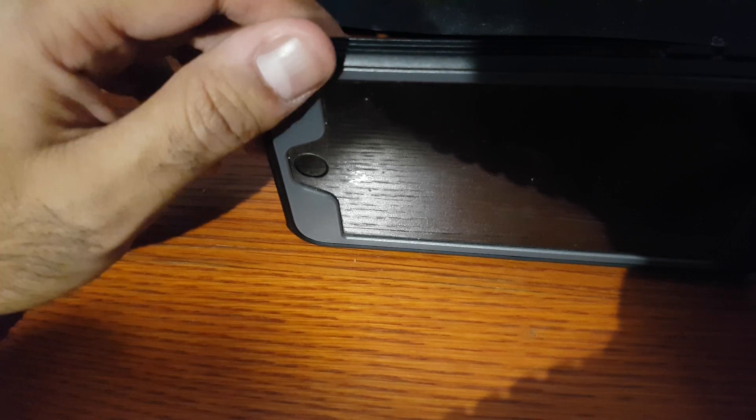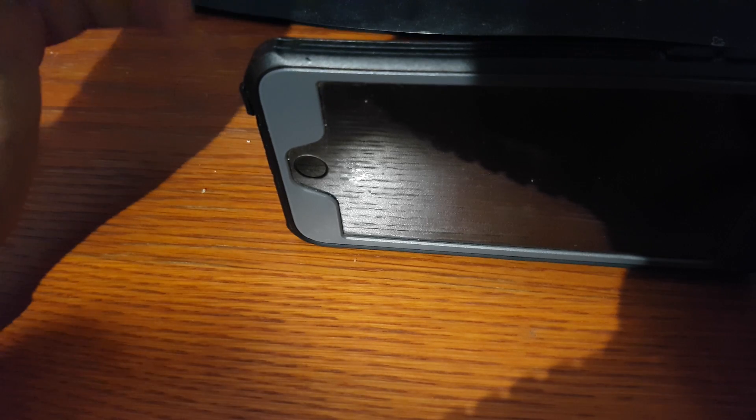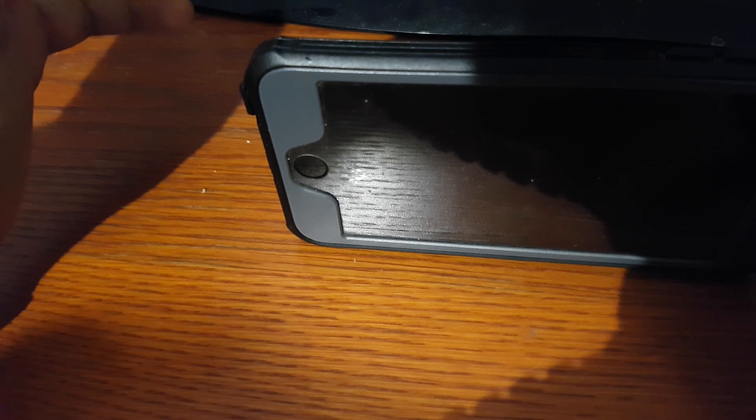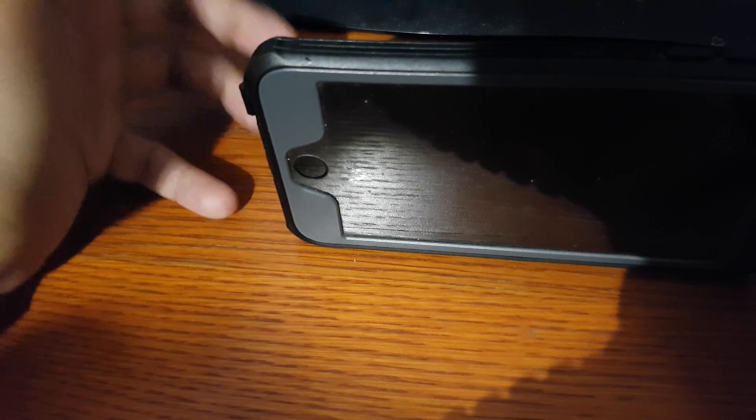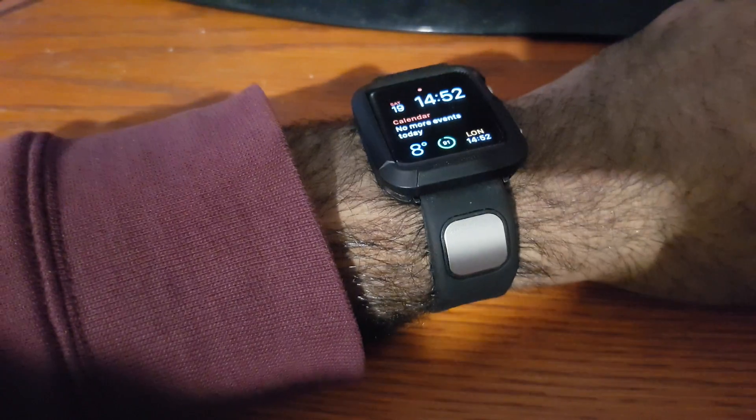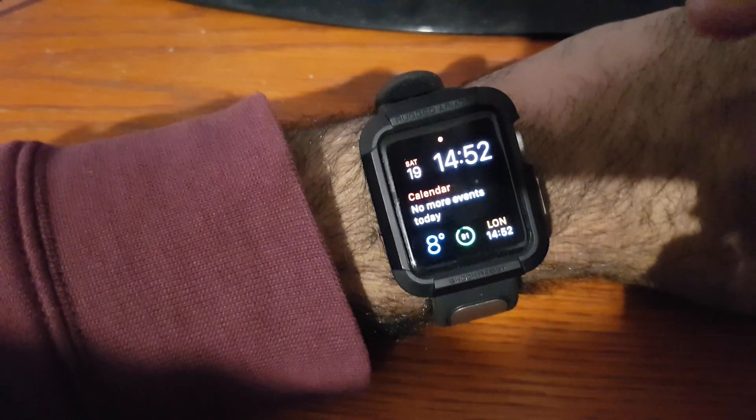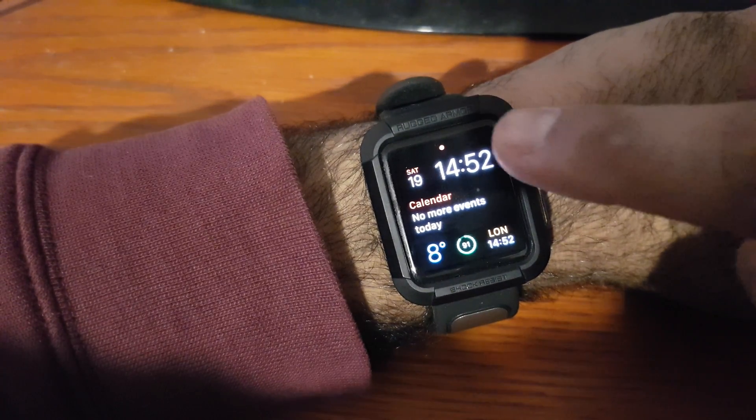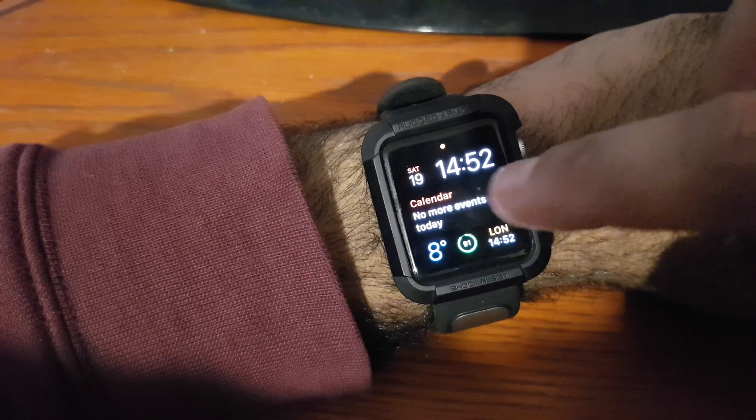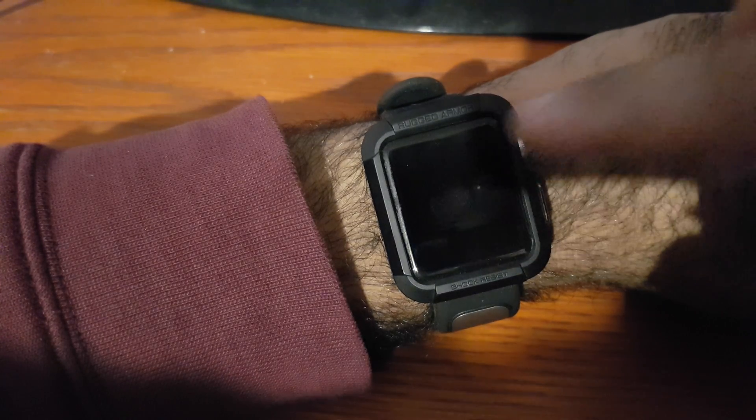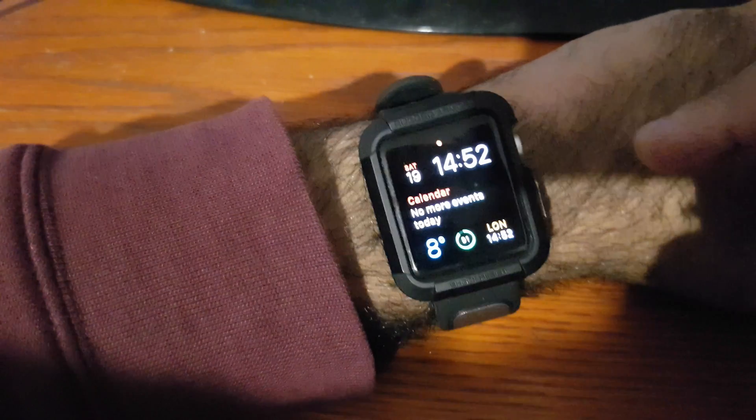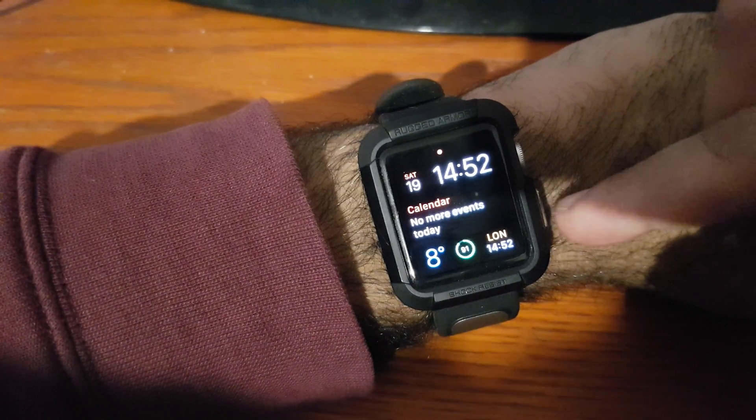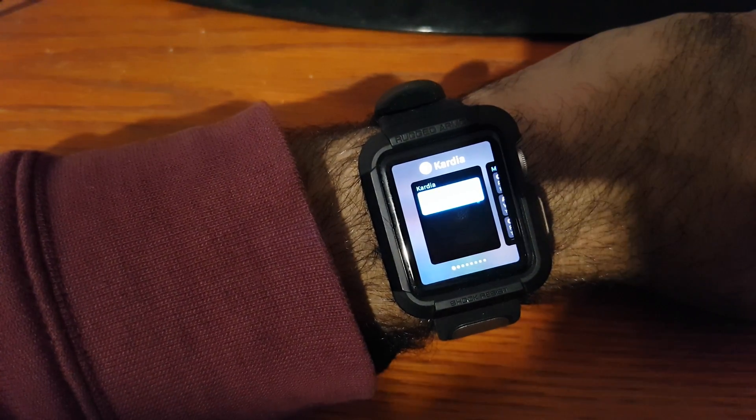You might want to take an ECG because you're feeling uncomfortable in a meeting, or you just want to, for whatever reason, you don't want to have to bring the phone out and open the app. So let's see how this works in practice then. Installation was fairly easy. And then it's a case of opening this, so pressing this button here.